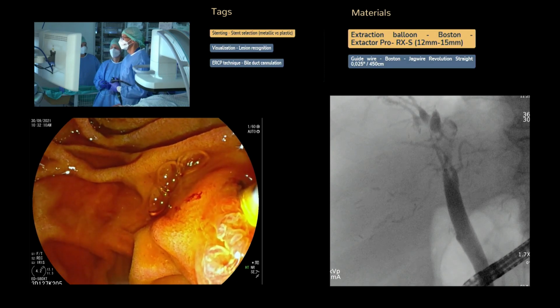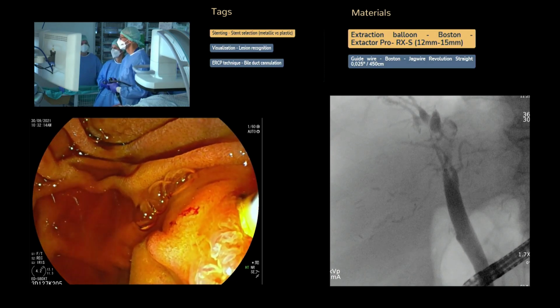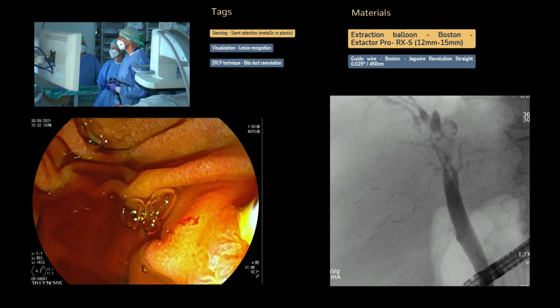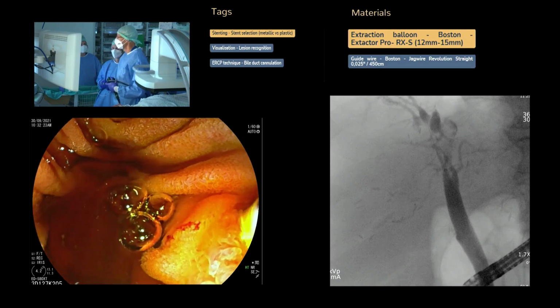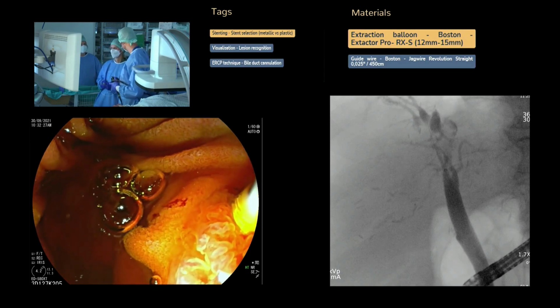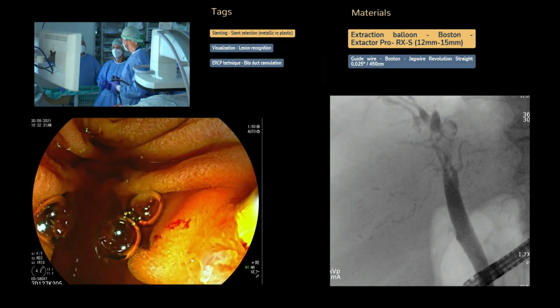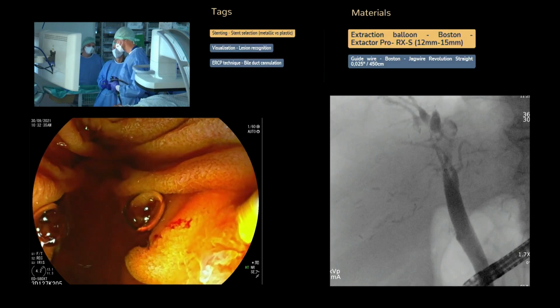I don't know what the approach is of the others. And from you, Jean-Baptiste, in this case, would you go for metal stenting directly, or would you go for plastic stenting first? It's a palliative setting. It's palliative, yeah. I think this is a very complicated question too. But in our unit, perhaps we will put a metallic stent, just for the right part, we will put a metallic one.